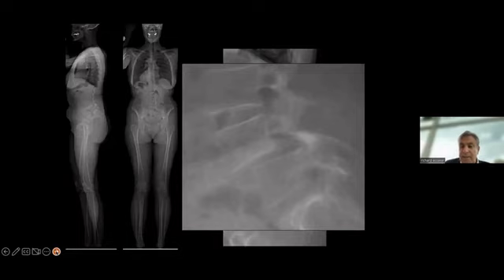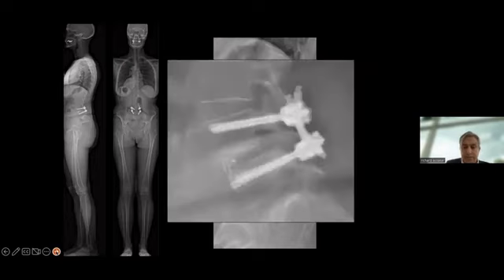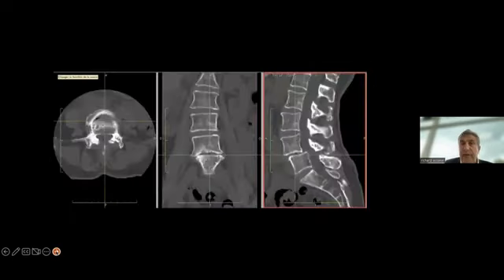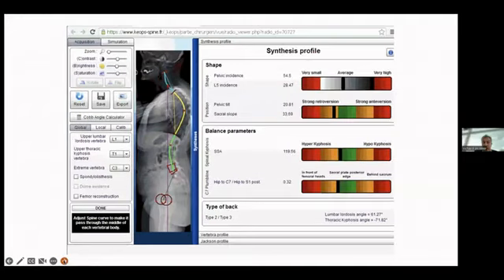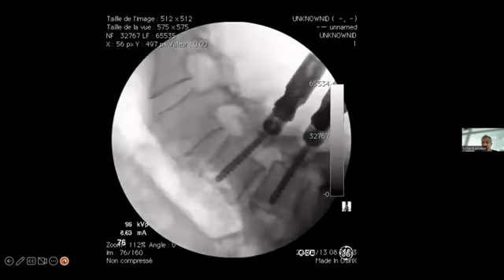Here is a spondylolisthesis at L4-5 — this is a typical minimally invasive case with cage, screws, and rod insertion percutaneously. When the patient has a low pelvic incidence, as in this situation with a pelvic incidence of 54 degrees, I perform a typical TLIF: placing Jamshidi needles, then wires. My two screws are placed on the contralateral side, opposite the symptomatic side.